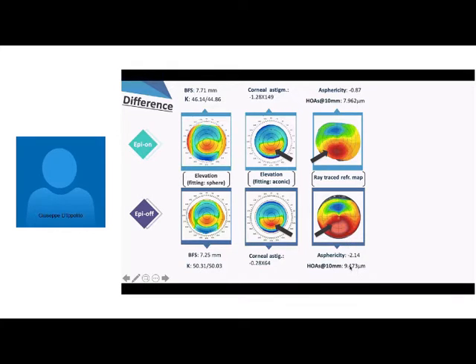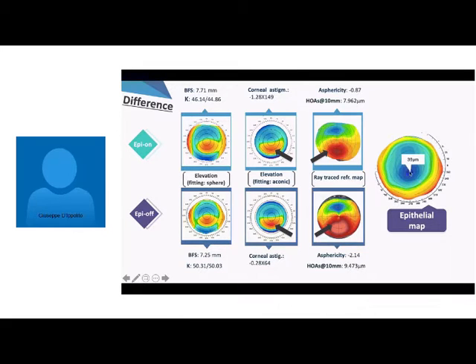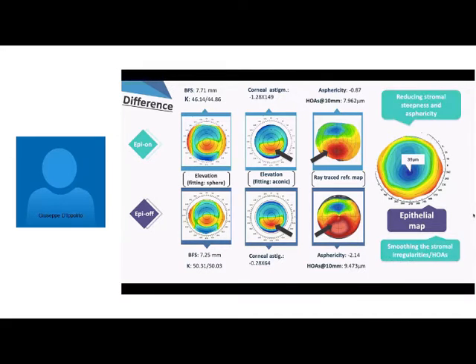Also the irregularities were much more pronounced on the stromal side. So this epithelial map, a concave epithelial lens 39 microns thick at the center and some 78, 80 microns at the thickest on the periphery, is actually doing several things.